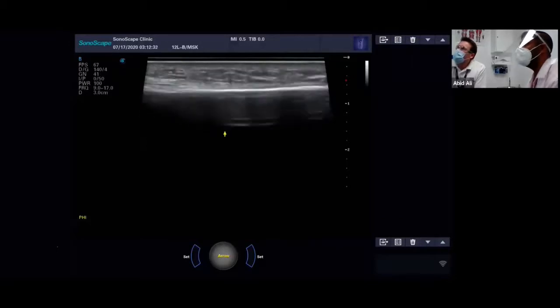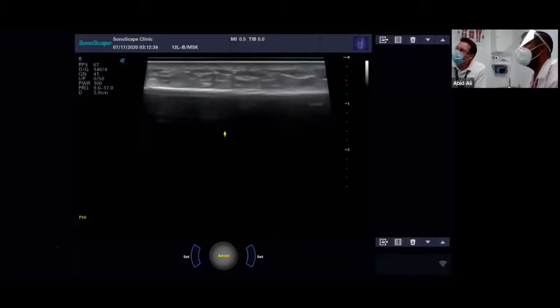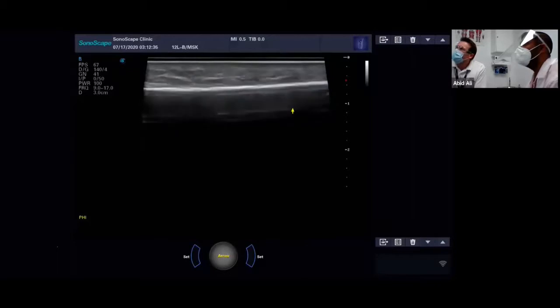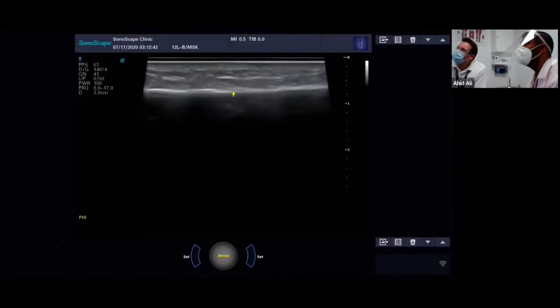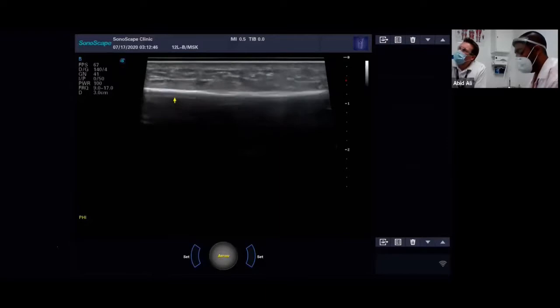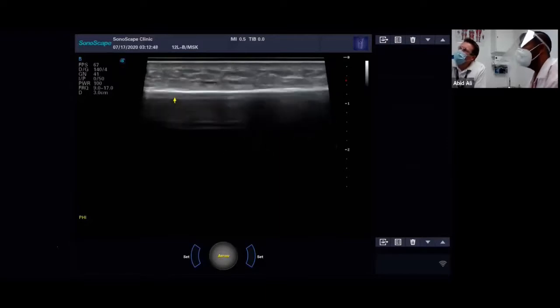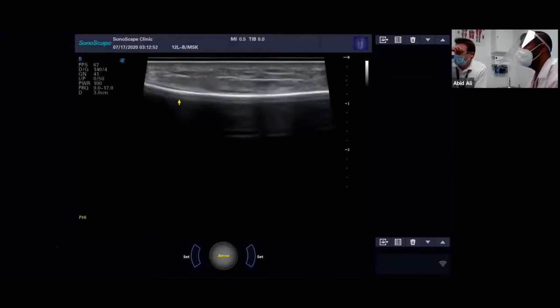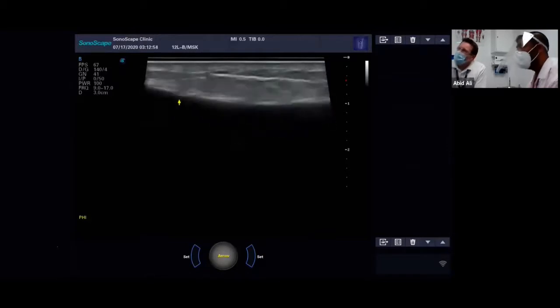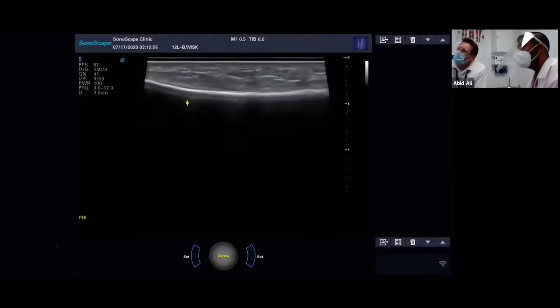Okay, so let's follow the tibia then. We're going to follow it up for you just to show you a little bit more bone. And now we're going to start to follow it down the tibia. I like to just wiggle forwards and backwards as I'm moving, because we're kind of interrogating the bone a little and trying to keep it bright white.